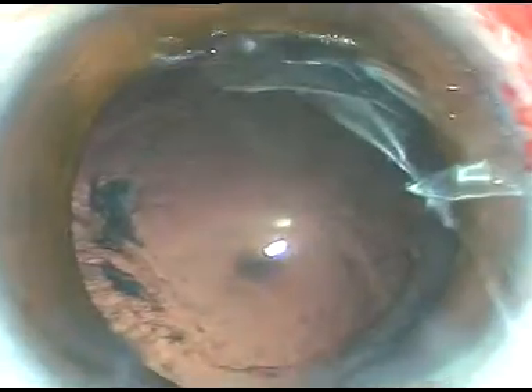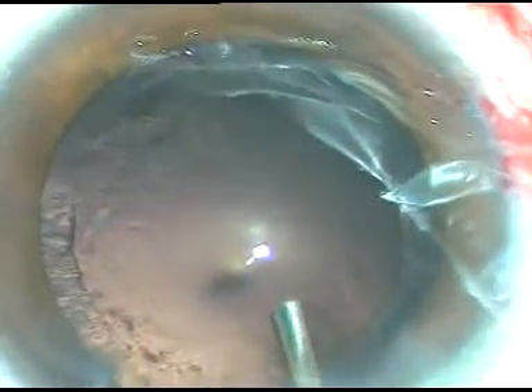Now I am trying to pull the thick epinucleus. As the fluid wave goes around, natural hydrodissection occurs — as Dr. Naranbar Desai says. He does surgery without hydrodissection in all cases. Now there are a lot of cells and a lot of cortical matter in this case.